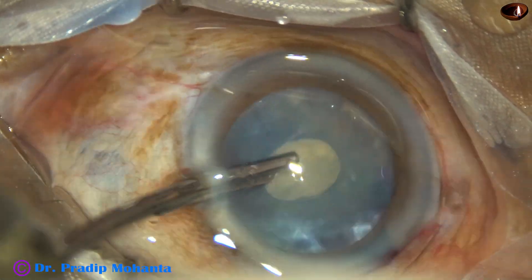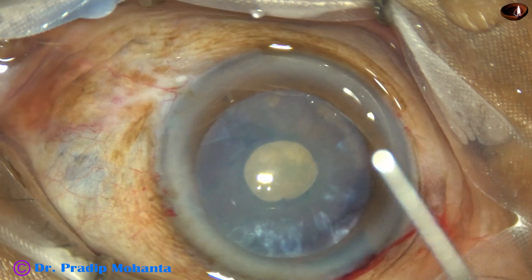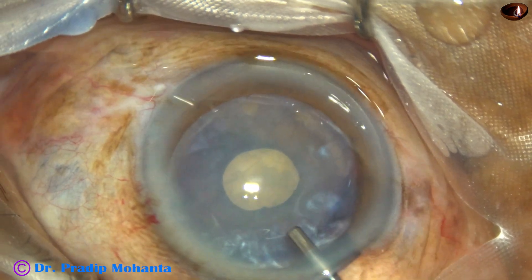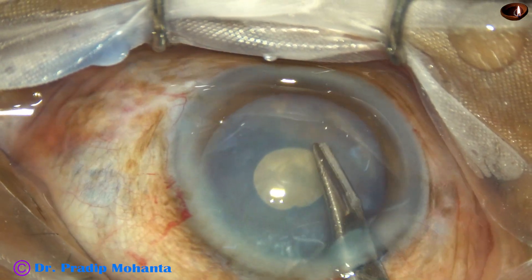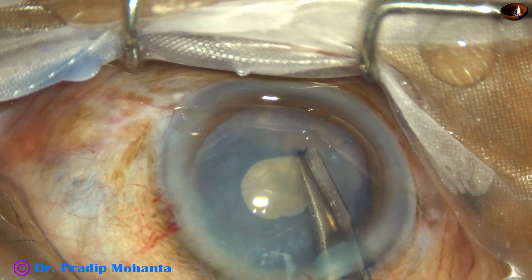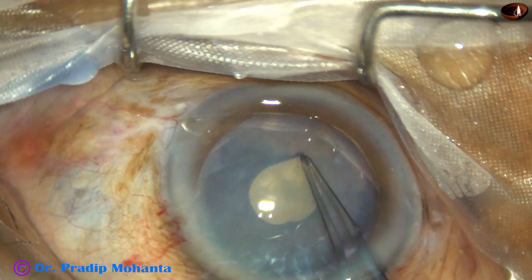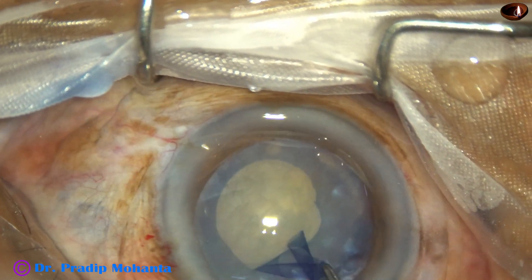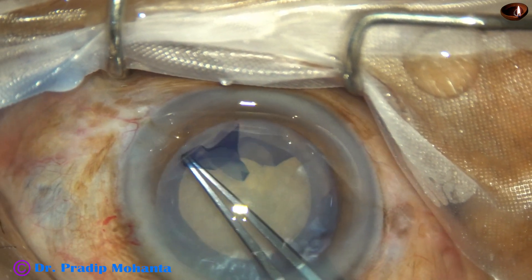And now the anterior capsule will be flat in all quadrants. Unless the anterior capsule is flat in all quadrants, do not try enlarging the rhexis — you will find that in the part which was elevated, the capsule will run out. And now, make a small nick at the margin of the mini-rhexis and enlarge it. I am enlarging the small rhexis into an adequate size, making it almost five millimeters.